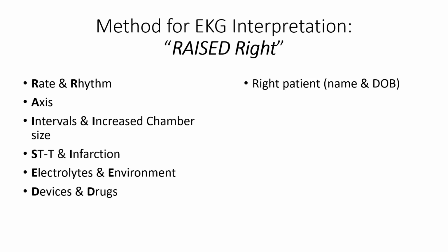In the heat of a STEMI or a heart attack, they will print off the EKG with no patient information on it, and somebody forgets to slap a patient ID sticker on there, and then you've got this nameless EKG sloshing around in no man's land. That's not the way to do that. You want to make sure that every time somebody hands you an EKG, if you put an interpretation on there, you need to make sure and put the patient's name and date of birth if they haven't done so already.